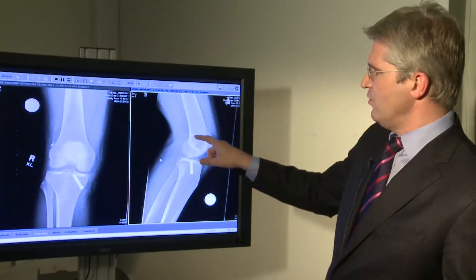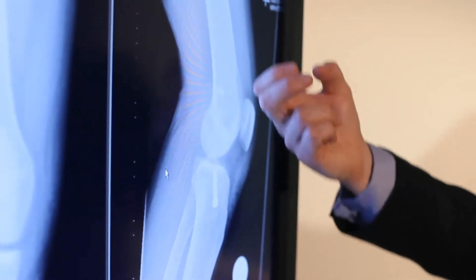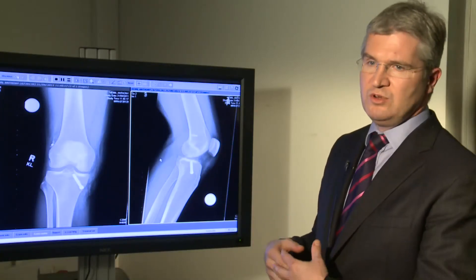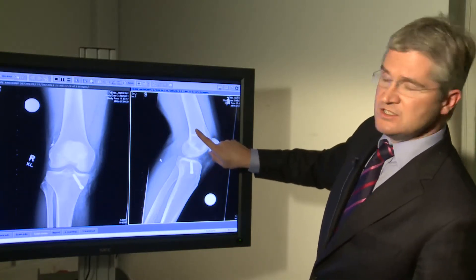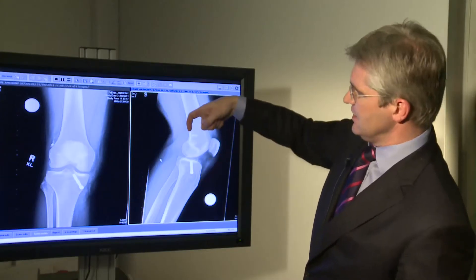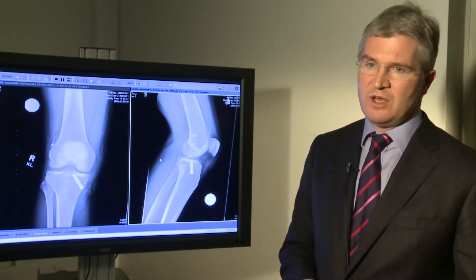You can see very clearly four holes: one for the loop of nylon that suspends the graft inside the knee, and the other for some toggling sutures so that we can pull the button up and pull it externally out of the pilot hole in its long axis. The pilot hole is wide enough to accept that, and then we flip it so it can no longer escape back down that pilot hole — it is caught on the side of the bone.